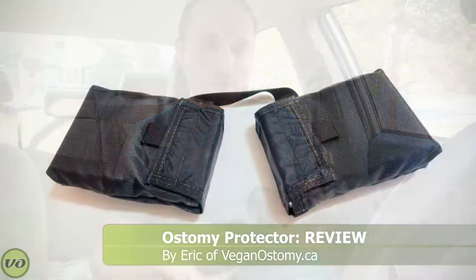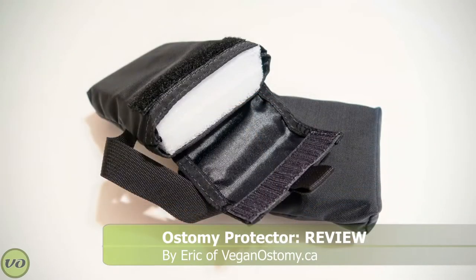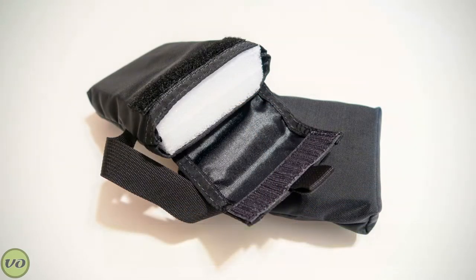So first, to tell you a little bit about this product — this is primarily meant to be used as a stoma guard of sorts, primarily for your seat belt. It will help to protect your stoma from the impact of having your seat belt over it. I'm going to show you exactly what the problem is and then how this product helps to resolve it.